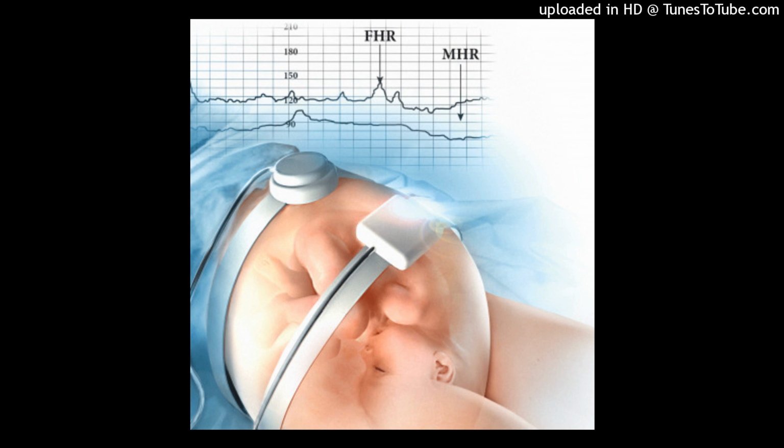Benefits of ultrasound and tokodynamometer transducers. The benefits of ultrasound and tokodynamometer transducers are as follows. Non-invasive, easy to apply, may be used during both the antepartum and intrapartum periods, sometimes used with telemetry when available, does not require ruptured membranes or cervical dilation, no known risks to woman or fetus, provides continuous recording of the FHR and UA.